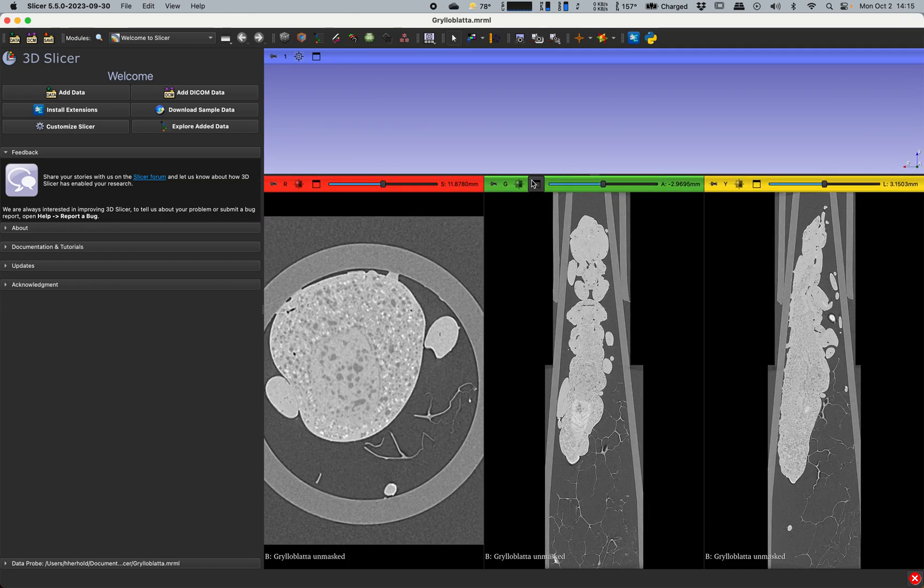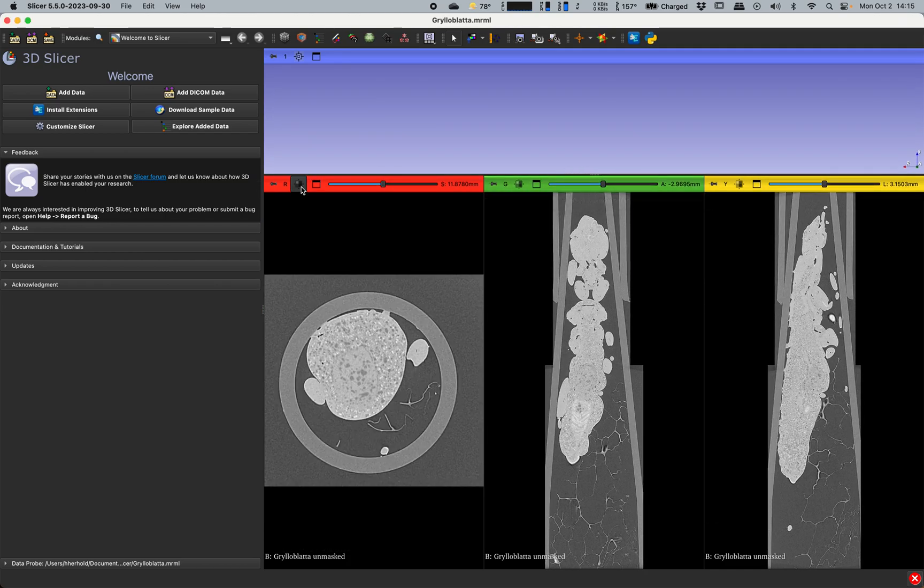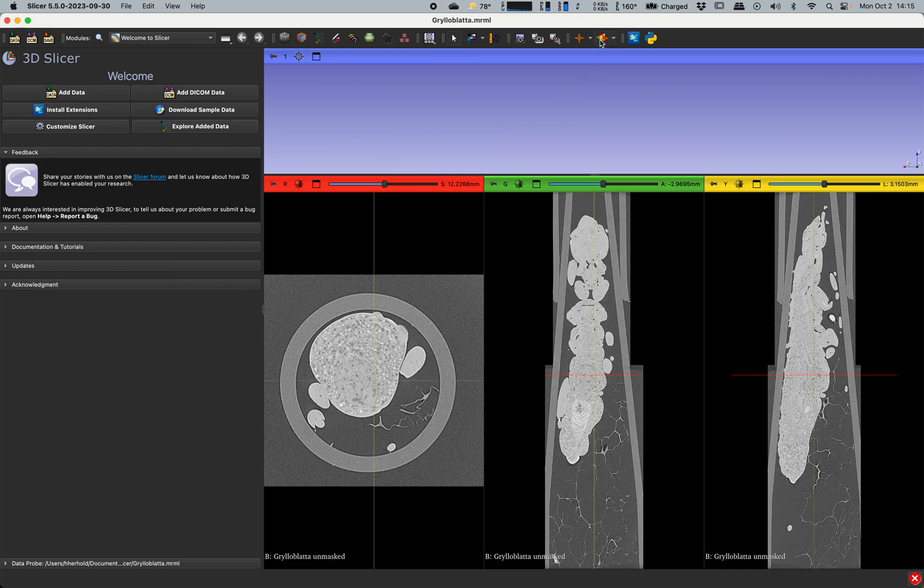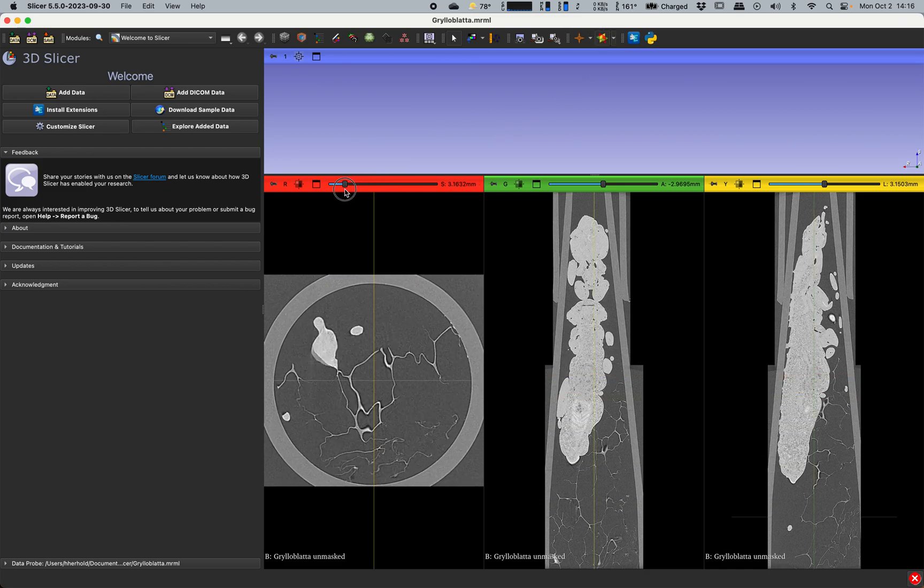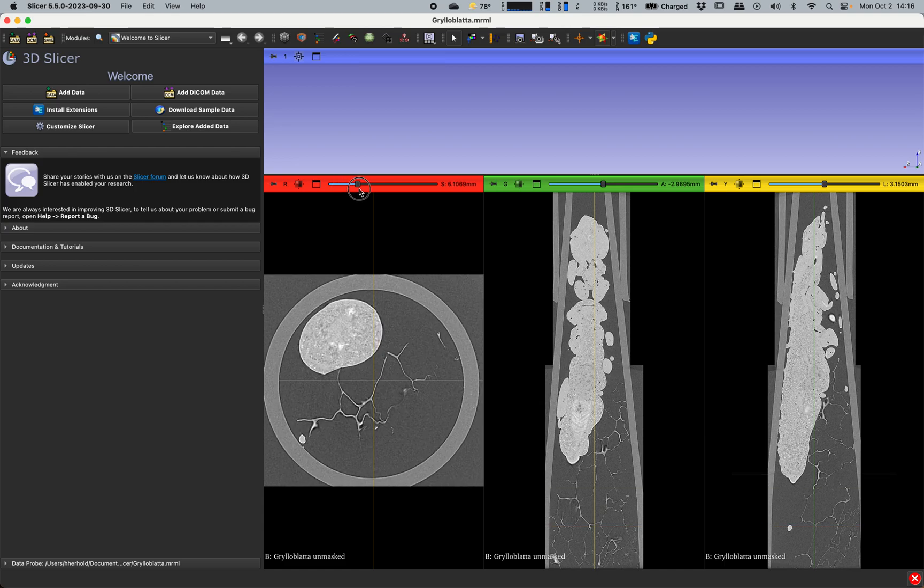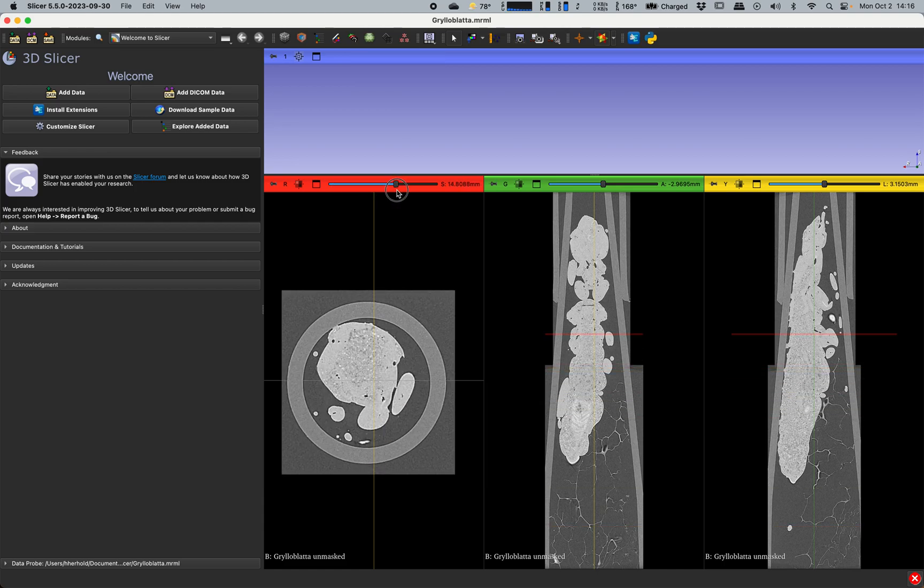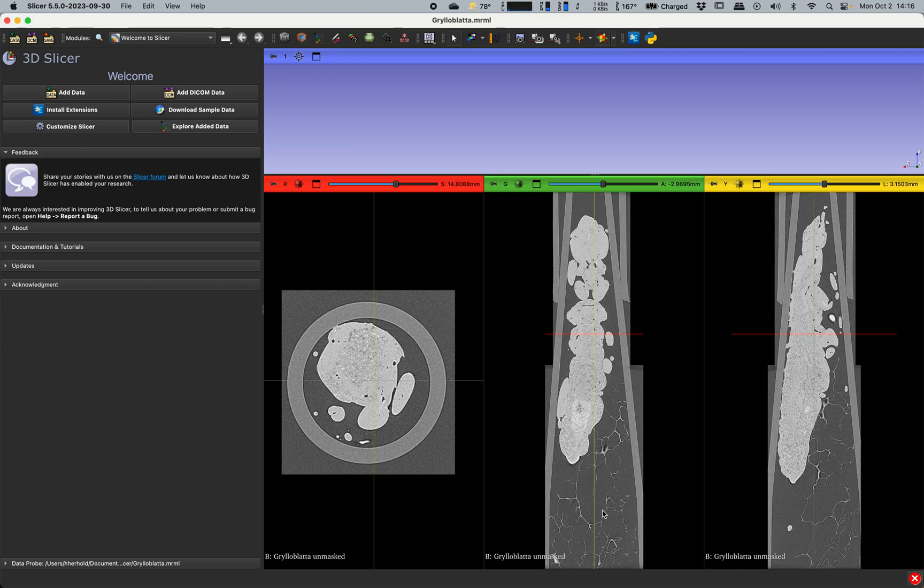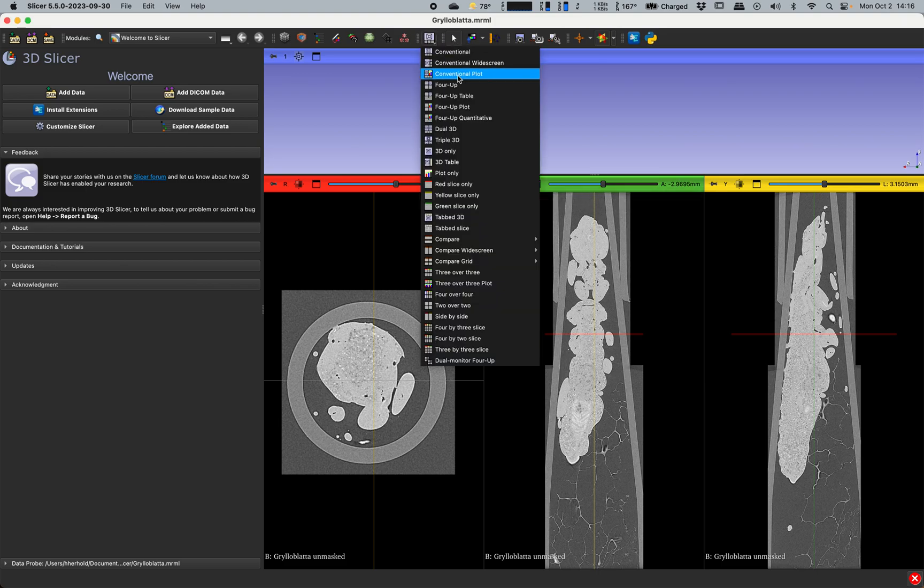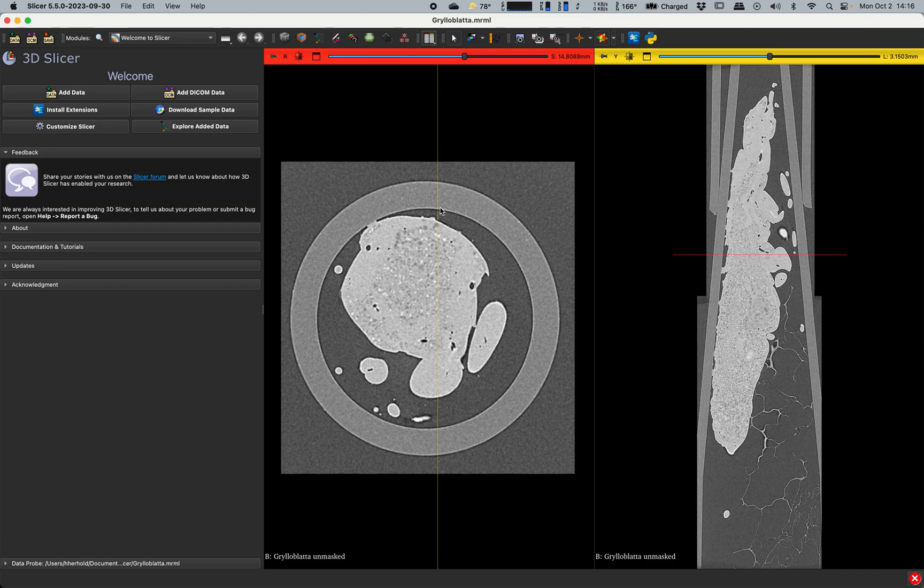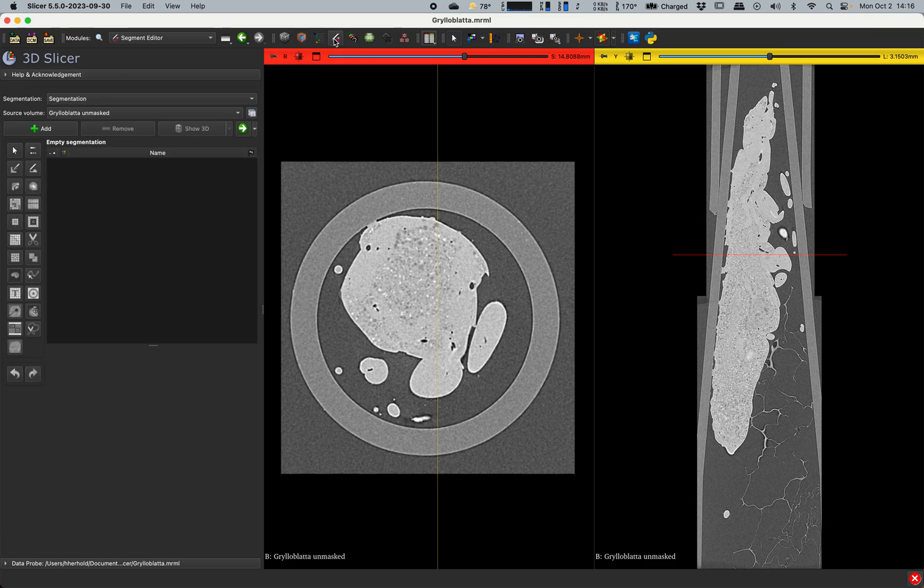So if we look at this scan as we go through the slices here, you can turn on slice intersections here so you can see where things are as we go up and down through the volume. There is the insect and then it is inside of this vial, this eppendorf tube that we scanned the insect in. We really don't want to look at all of this vial or the packing material and so on. So we do an operation that I refer to as vial removal. To do that, I go to the side-by-side view in Slicer.